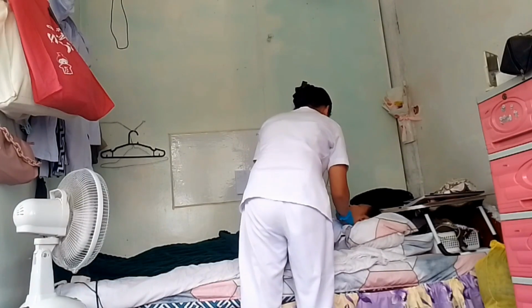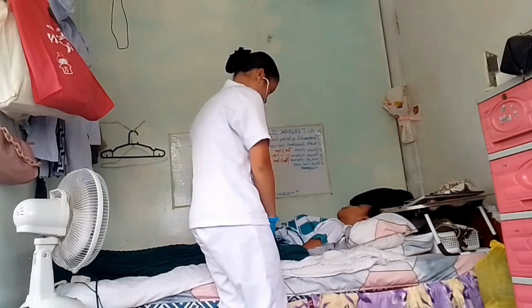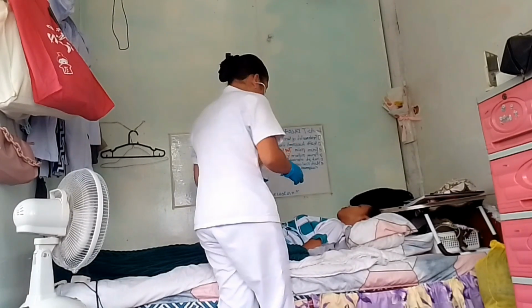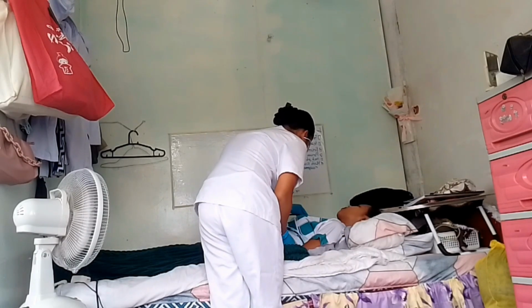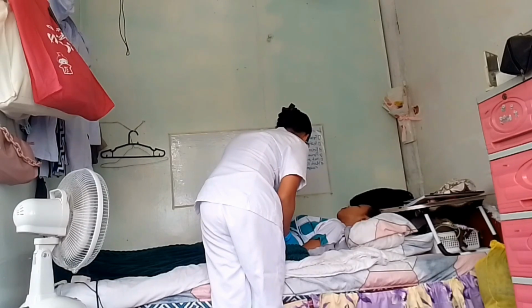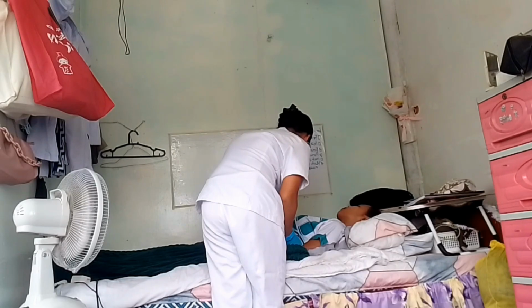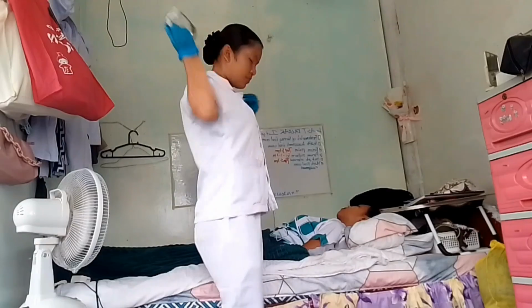Okay. Then, you need to auscultate using the bell and the diaphragm of the stethoscope. So upon auscultating the pulse of the aortic, the pulmonic is normal.